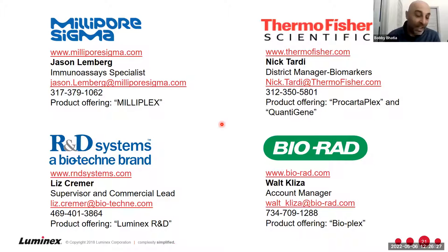Are you going to find exactly a fivefold difference between something and something? If you do a comparison, no. You might find this gives you a tenfold difference, they may find a fivefold difference, this may be a 20-fold difference, and so forth. So every company has their own validations.